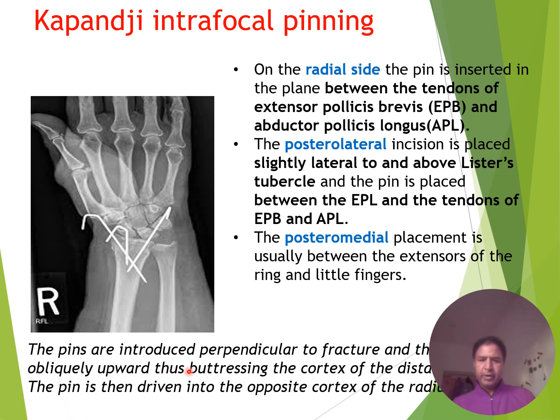The pins are introduced perpendicular to the fracture, oblique upwards, buttressing the cortex of the distal fragment. The pin is then driven into the opposite cortex of the radius.